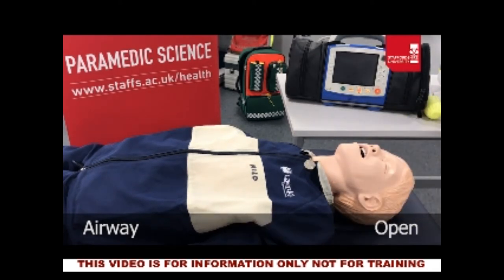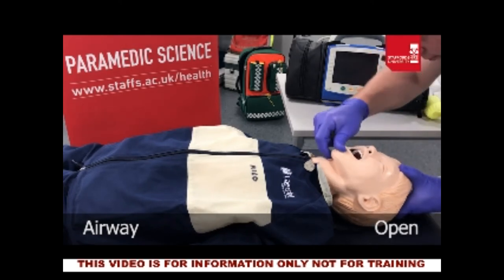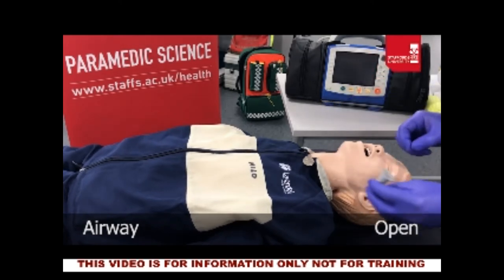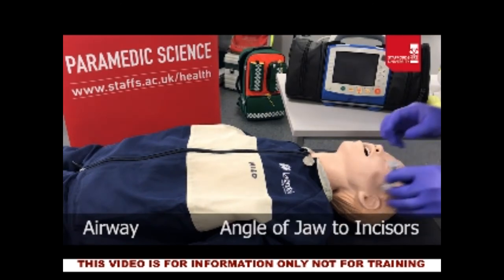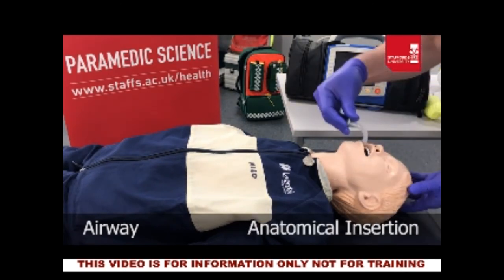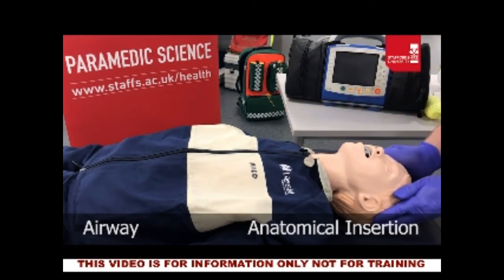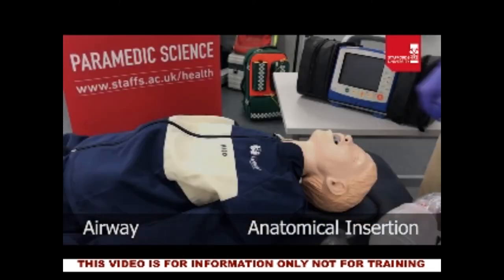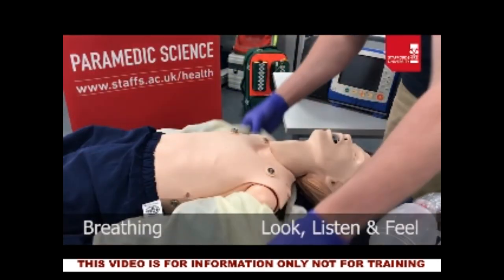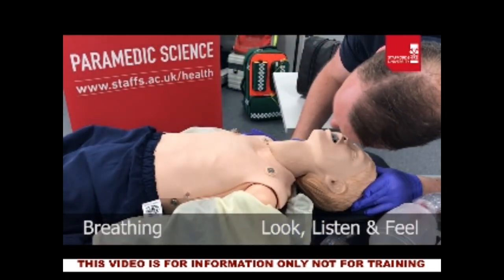Once the airway is clear we open it — there is no sign of C-spine concern on this occasion so we are going to use a head tilt chin lift. We then size up and place an OPA. As this is a paediatric patient we insert the OPA anatomically to avoid damaging the soft palate at the roof of the mouth. Once finished we expose the chest and look, listen and feel for breathing for up to 10 seconds.